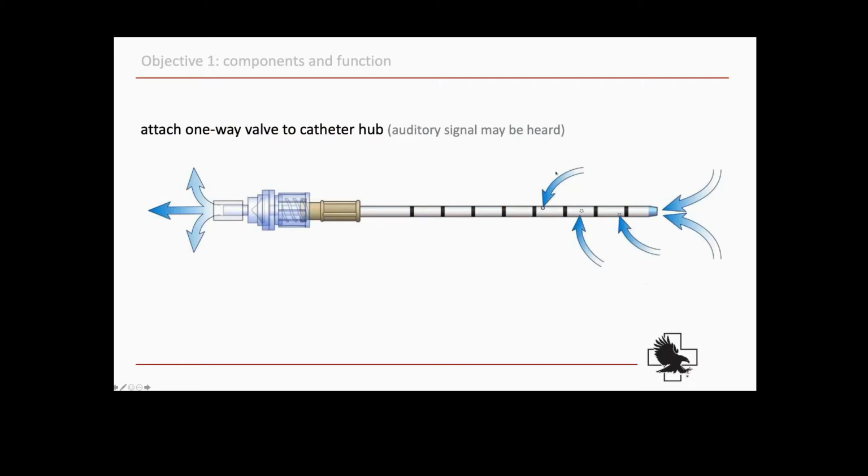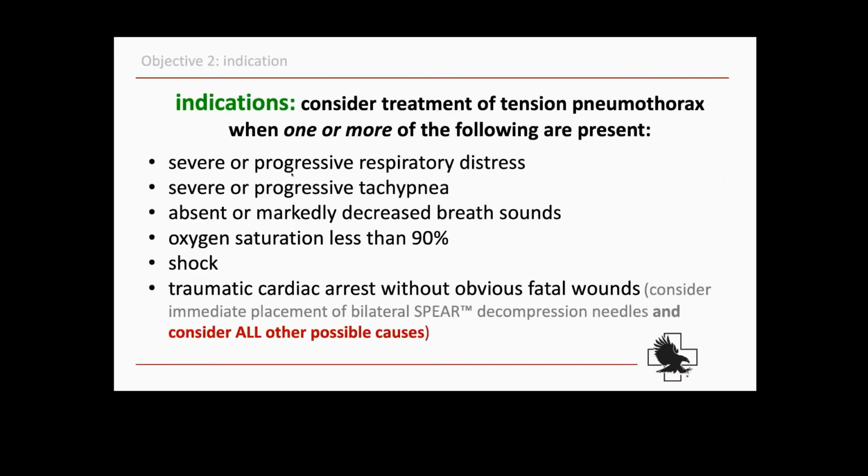And as they're showing here, these blue arrows heading towards the catheter, that's where those fenestrated holes are, including at the tip. So you have a few different access points and hopefully less likelihood of things clotting off or getting blocked off once it's placed correctly. And then this one-way valve should be expelling air and not allowing air to be entrained back into the pleural space.